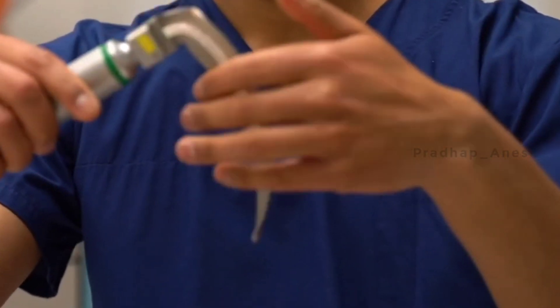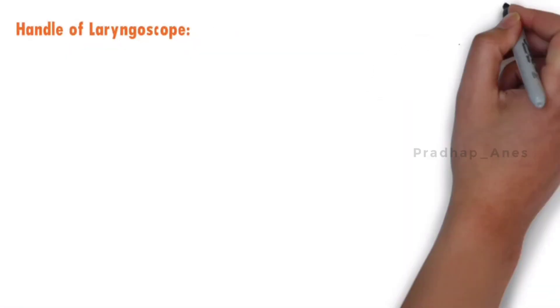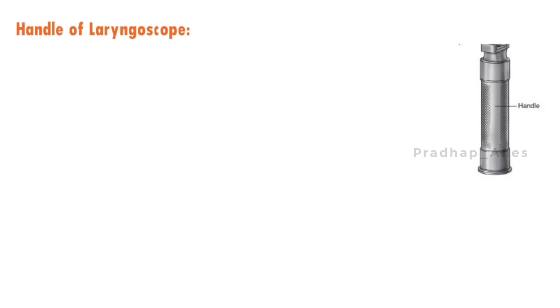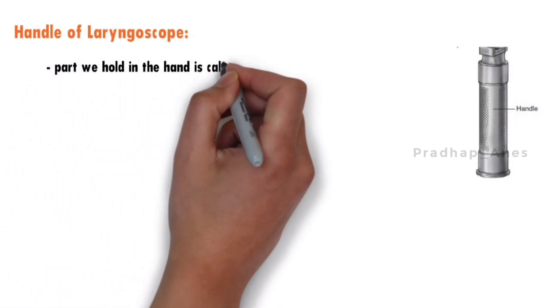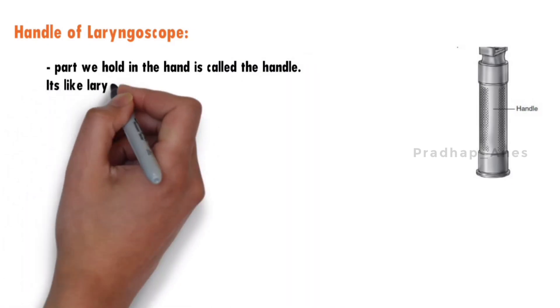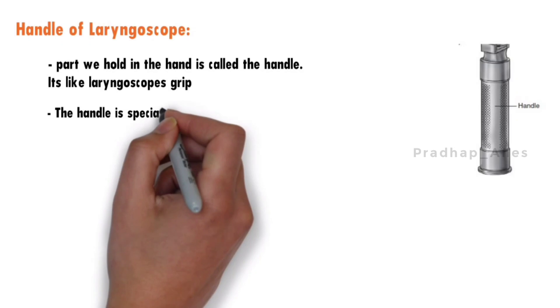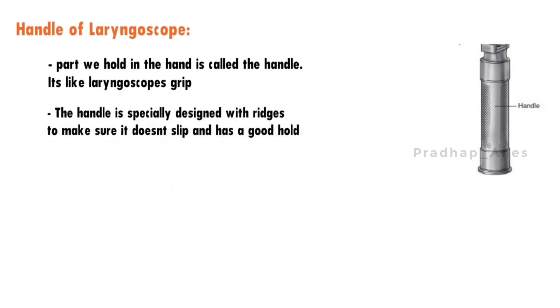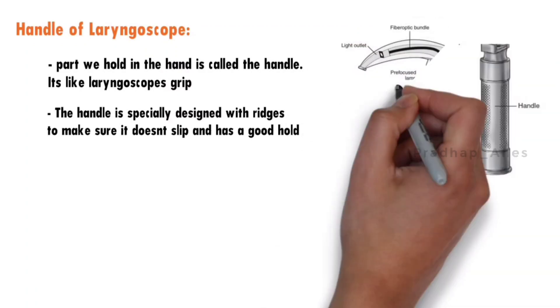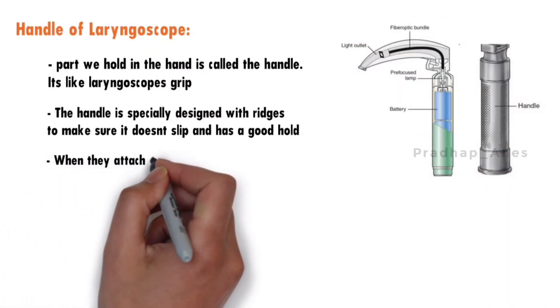The blade is attached to the handle by a hinge-type joint. The part we hold in our hand is called the handle — it's like the laryngoscope's grip. The handle is specially designed with ridges to make sure it doesn't slip. Inside the handle, batteries provide power to the laryngoscope.